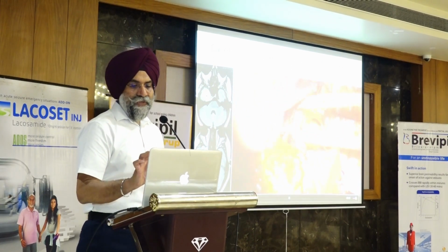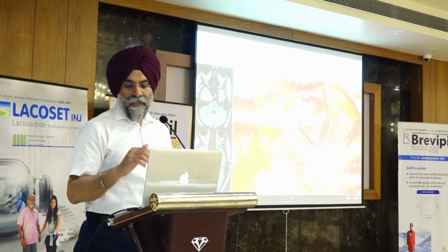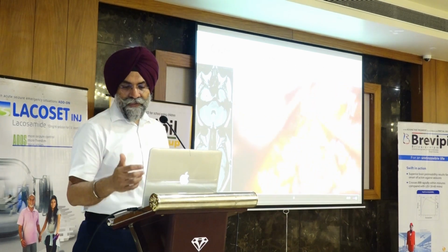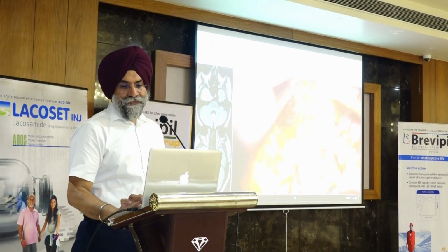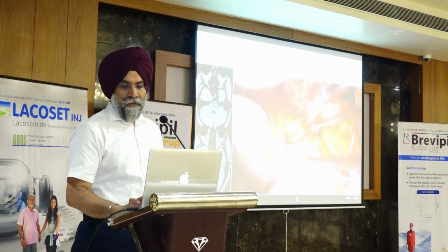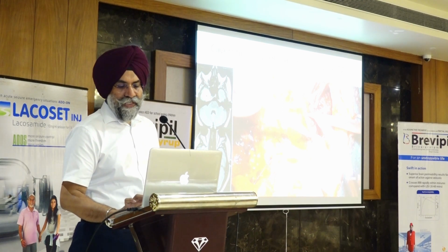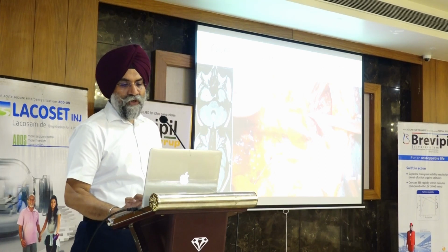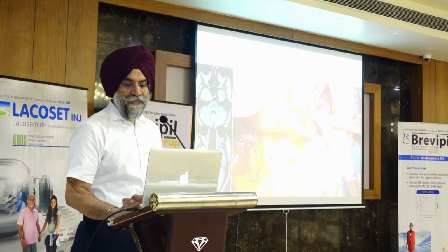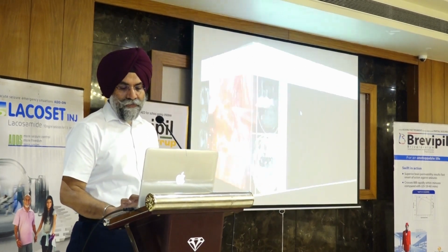So now the only thing is that we have to find out where the internal carotid artery is, and you just have to go toward the foramen lacerum, and you see there. So now you see that this is the internal carotid artery which is there. I have found the one end there. So now I was confident that it is okay. I have seen it. I started cutting because it was encircling it. I have to cut it. But something happened here. Sorry.